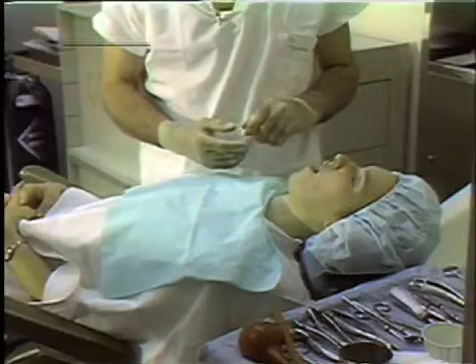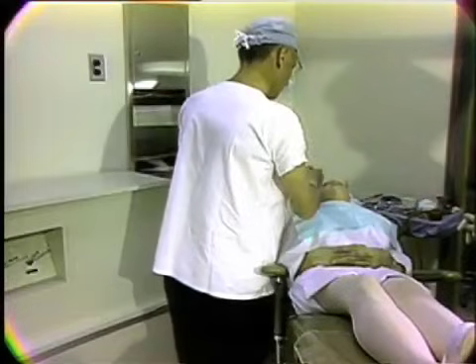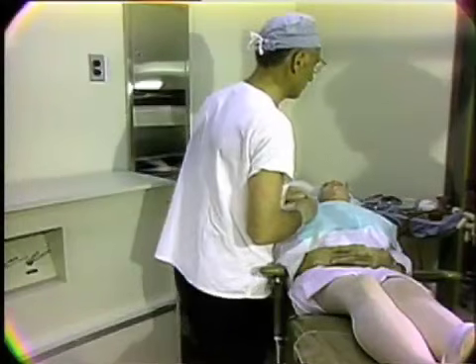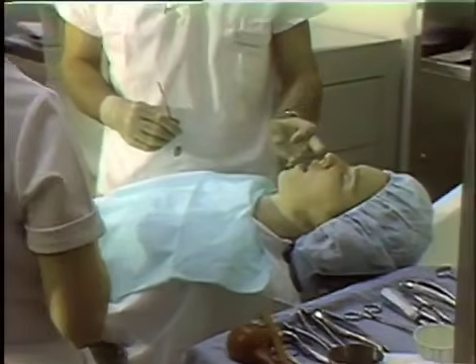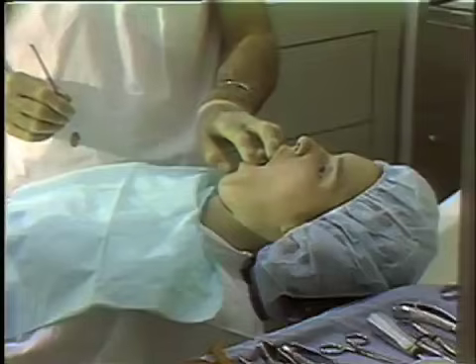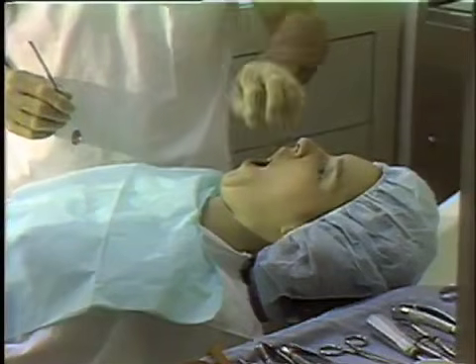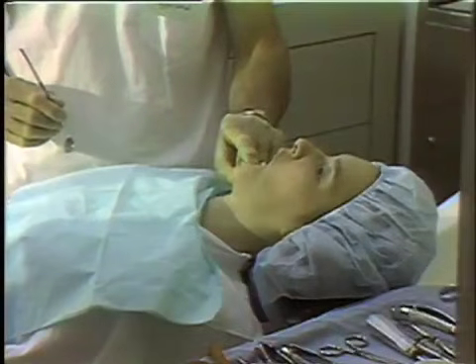Then with the operator positioned laterally, he's able to bend directly forward and have full direct vision of the maxillary field. In retracting the cheek for the maxillary field, one will remember that the buccinator muscle is put on the stretch when the mouth is opened. So if the patient is open to a maximum range, the cheek is tight and you cannot retract it well. So for retraction in the maxillary arch, we'll want the patient's jaws partially closed together.